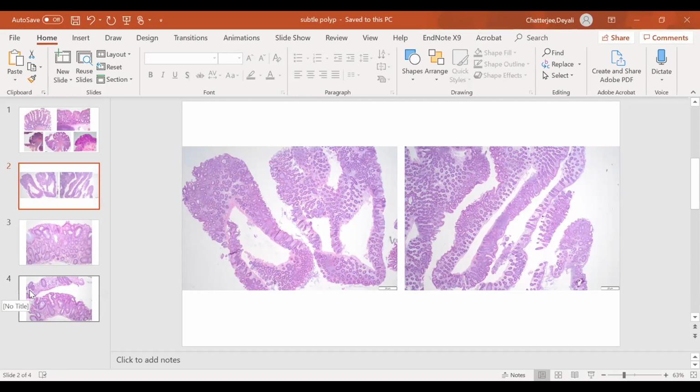It's really simple. You just require some paper to do this, and you put your specimen on this piece of paper. The paper will absorb the water from the specimen and then will make it oriented. Then you send it to the pathologist, and they will say, aha, this is very simple, this is an SSA. When you cut it like this, it is so difficult.